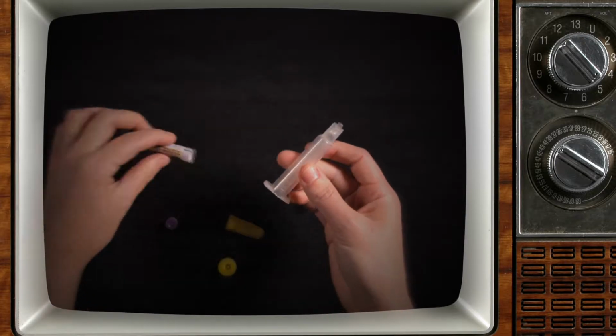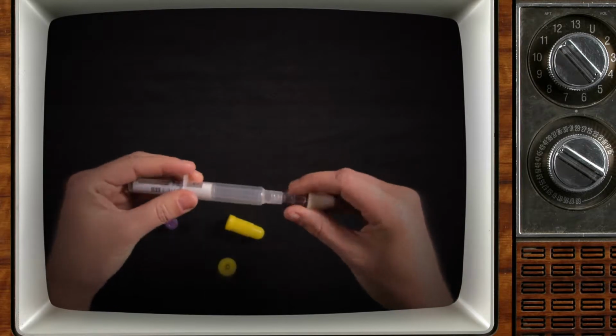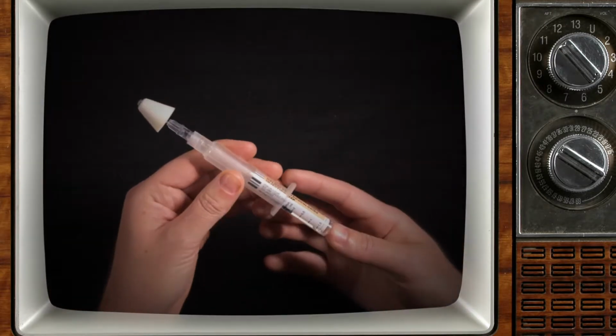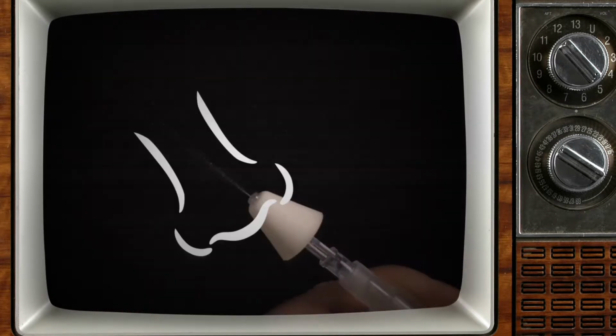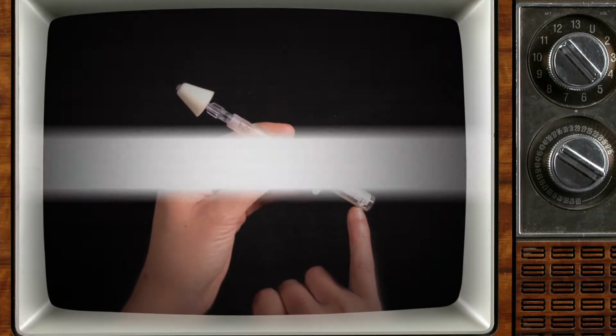Screw the naloxone capsule into the back of the syringe. Screw the atomizer onto the front of the syringe. Place the nasal atomizer in the person's nose. Grip the plastic wings at the base of the syringe and with your thumb, compress the naloxone capsule. Use half the naloxone in one nostril and half in the other to provide the most effective drug delivery.